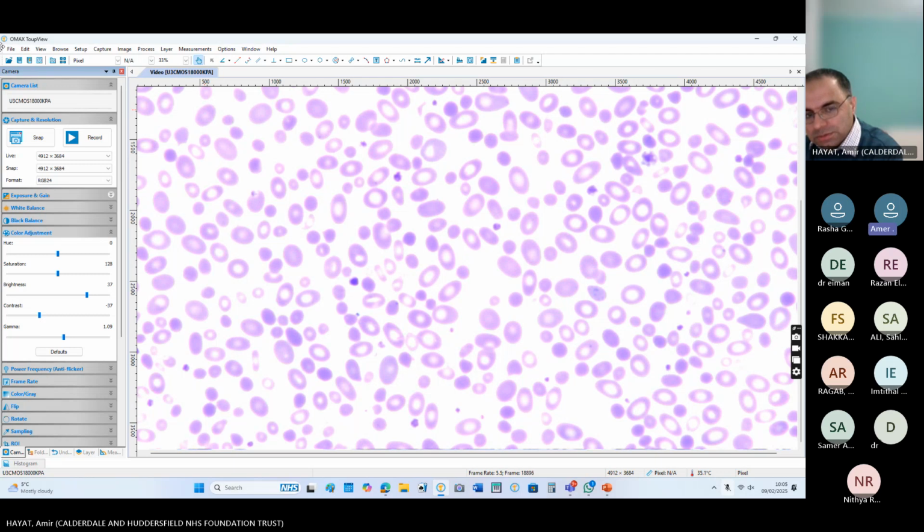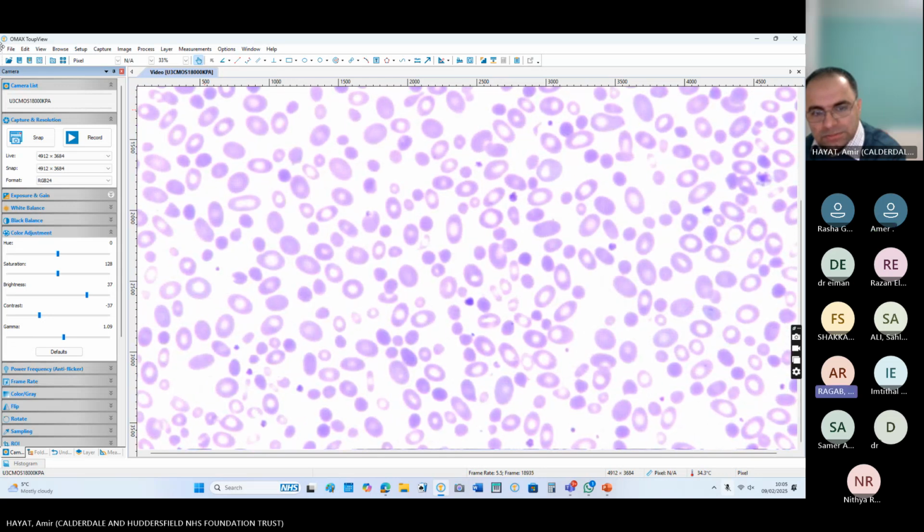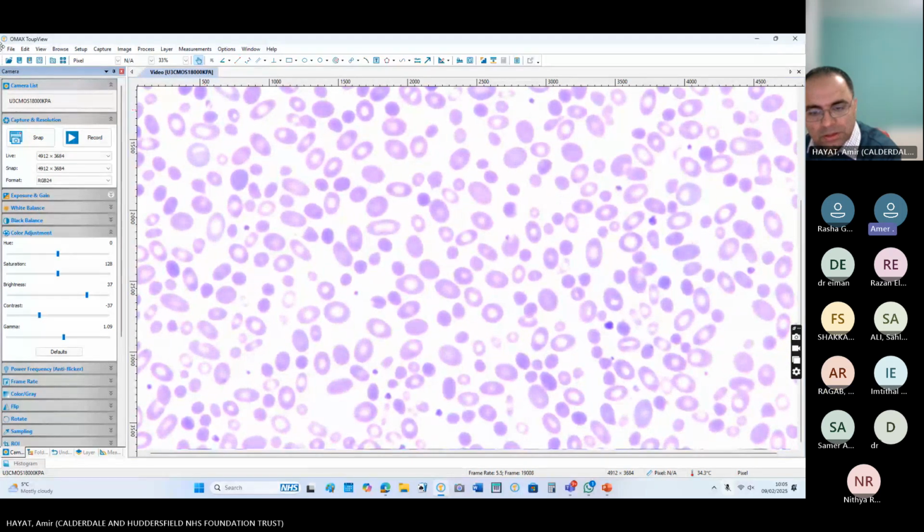If it was cold, there should be some red cell agglutination. Right, you are right. First step in hemolysis is always a DAT test to find out whether it is immune or non-immune. So the DAT test is negative here.